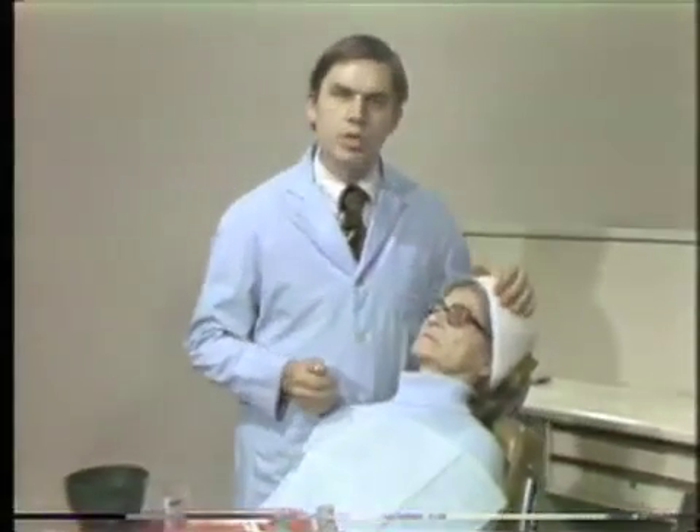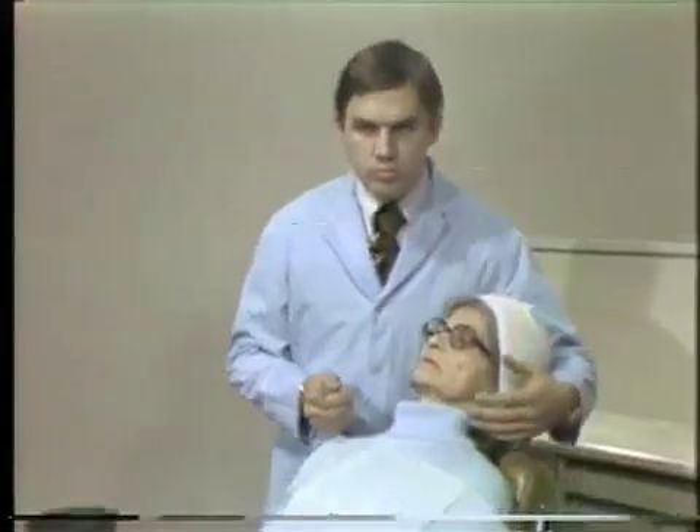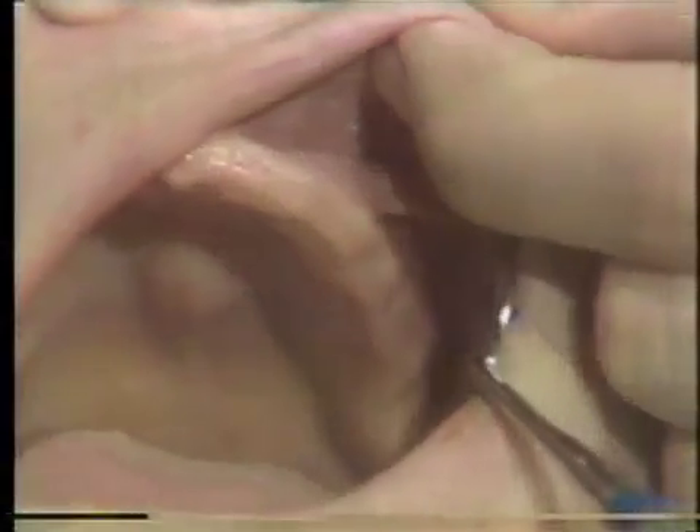Let me demonstrate the patient first. Please open. This is the maxillary residual ridge we are interested in. It shows the residual ridge.